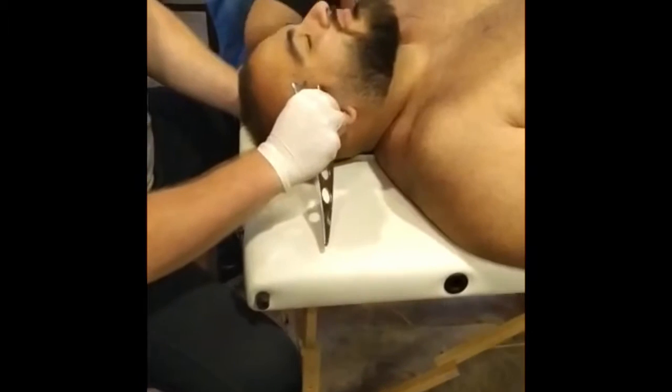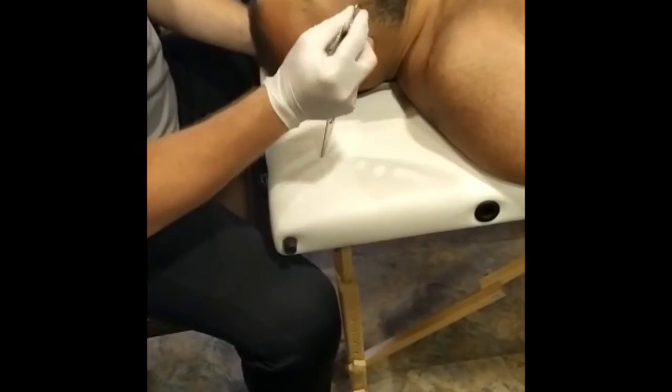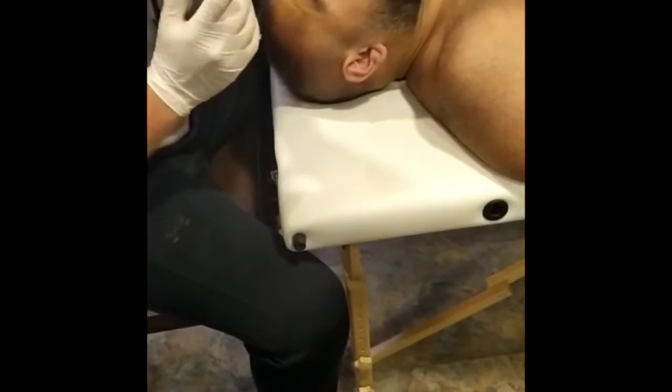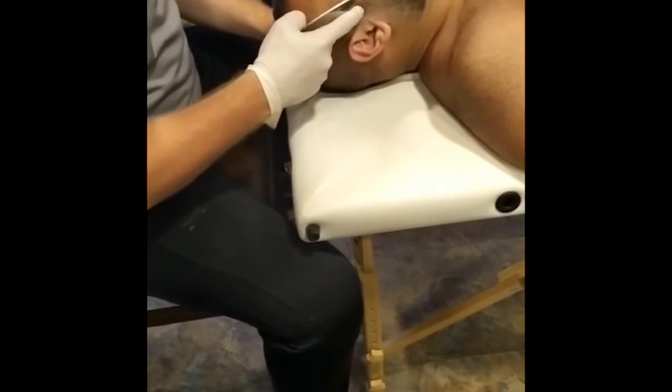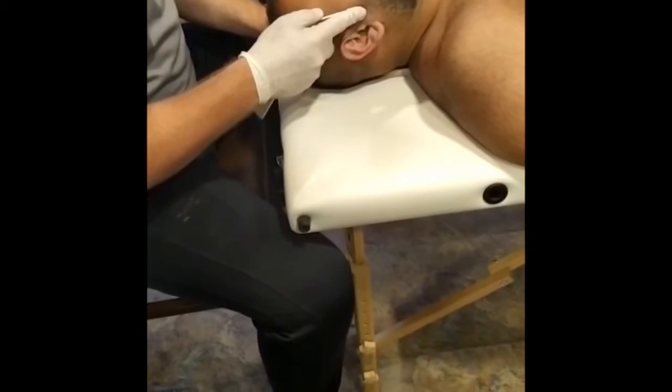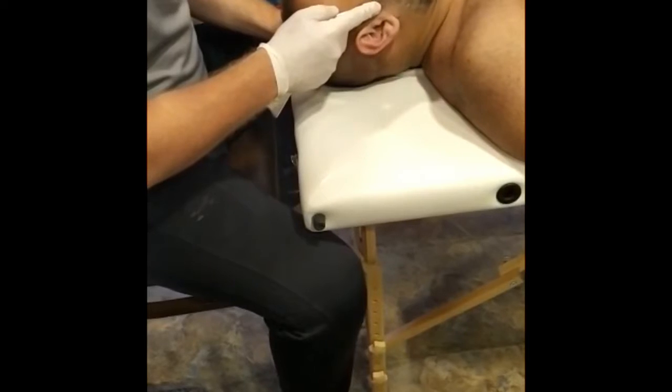So we're going to pin it down as he's opening it — he's going to hold it. We can also do a little bit of trigger point release as well, where I come with that number eight, index finger over top of the number eight, palpate where it's sore, and come down and just hold it as he's opening and closing his mouth.